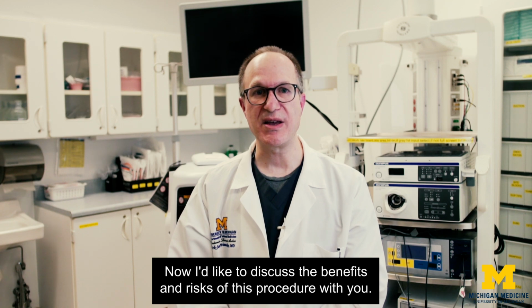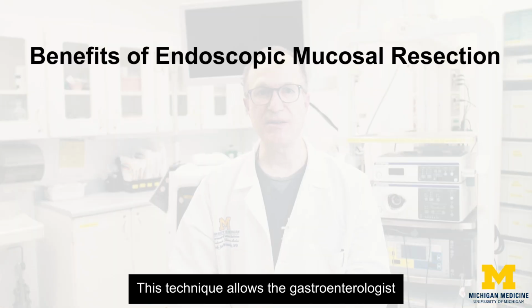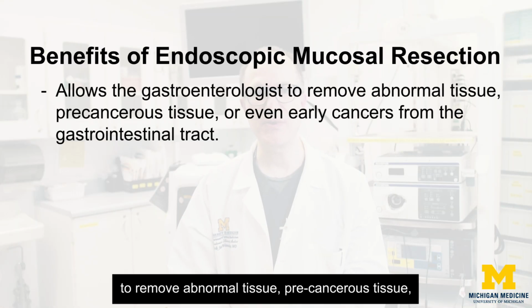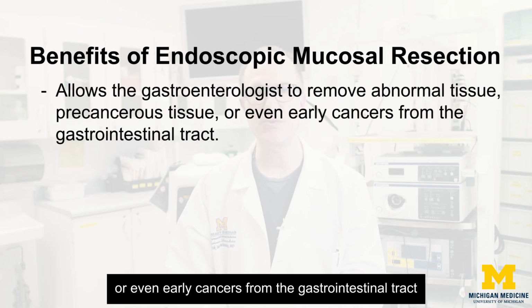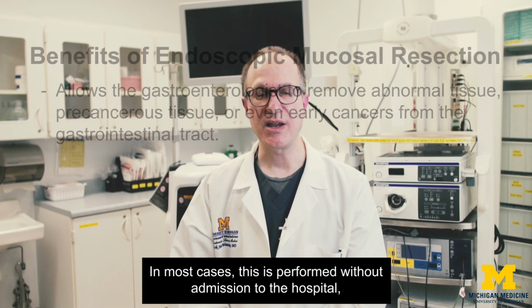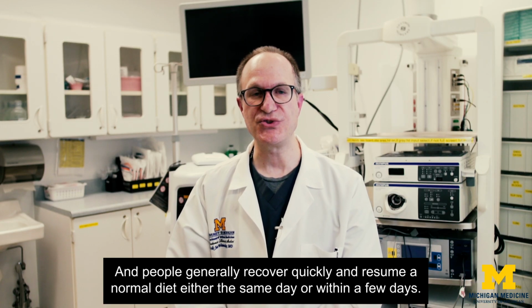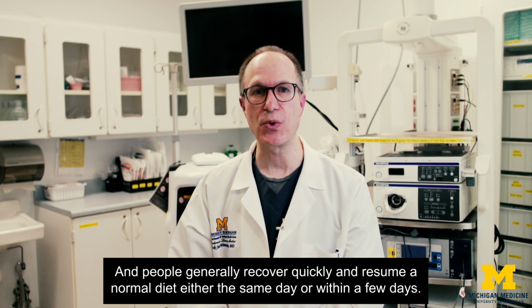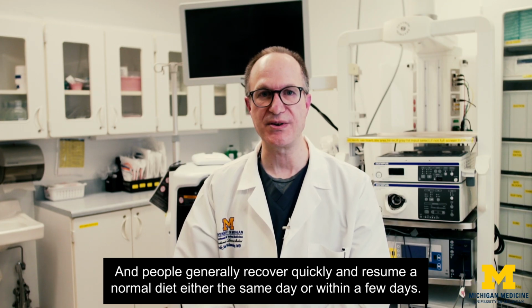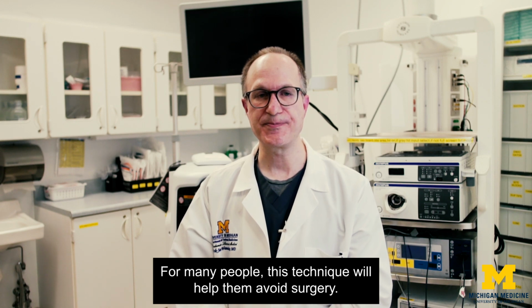Now I'd like to discuss the benefits and risks of this procedure with you. I will start with the benefits. This technique allows the gastroenterologist to remove abnormal tissue, precancerous tissue, or even early cancers from the gastrointestinal tract without surgery or incisions through the skin. In most cases, this is performed without admission to the hospital, and people generally recover quickly and resume a normal diet either the same day or within a few days. For many people, this technique will help them avoid surgery.